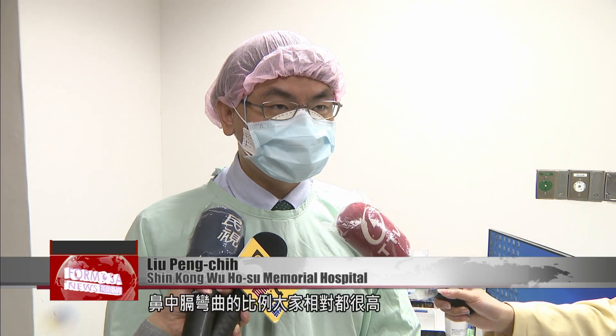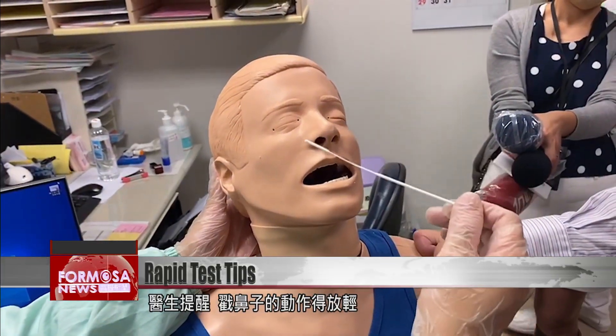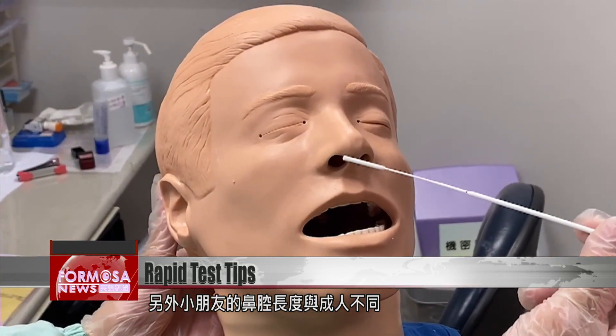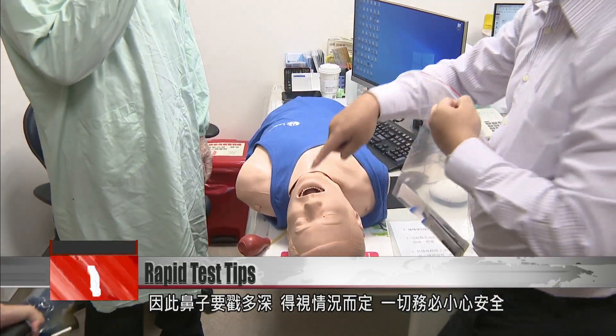The curvature of the nasal septum is relatively high, so start by taking a sample from whichever nostril is less obstructed. Using a gentle twisting motion to insert the swab can reduce the chance of injury to the mucus membrane. The doctor says being gentle is key, and since the length of children's nasal cavities differs from adults, it's best to be careful when gauging how deep to insert the swab.